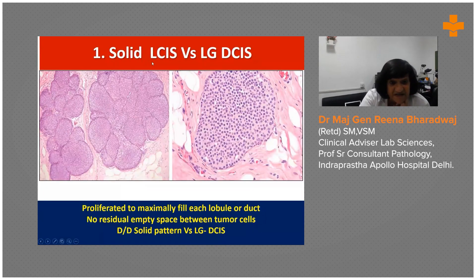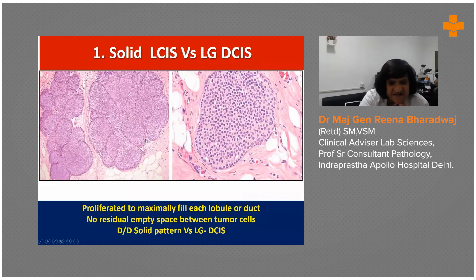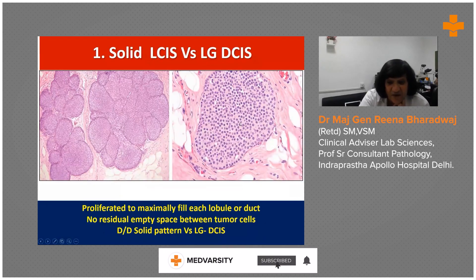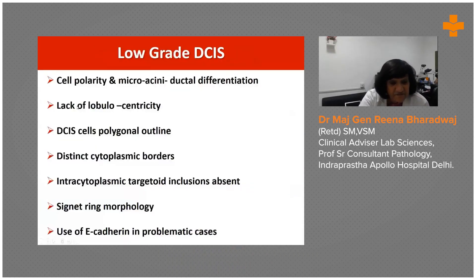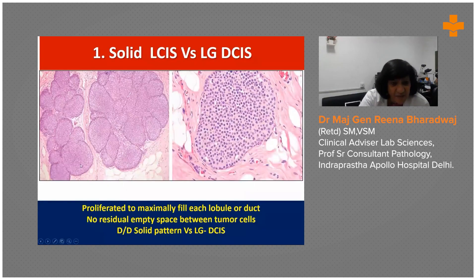The first mimic is solid LCIS. You can see clearly that the cells have proliferated maximally to fill the lobules. They are quite monomorphic and there are no residual spaces. If you wonder why this is not a low-grade DCIS, look at the cell polarity and look for micro-acini ductal differentiation. In this case, there is lobulocentricity.